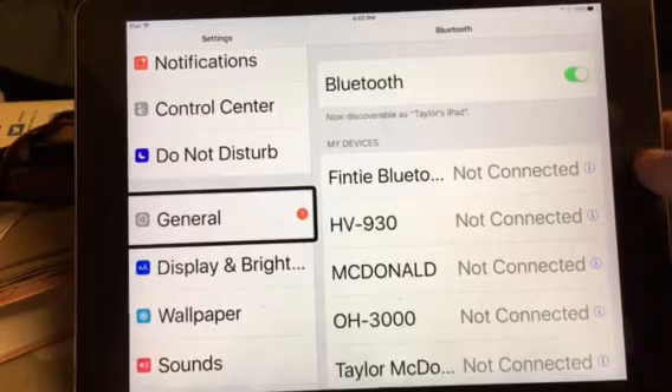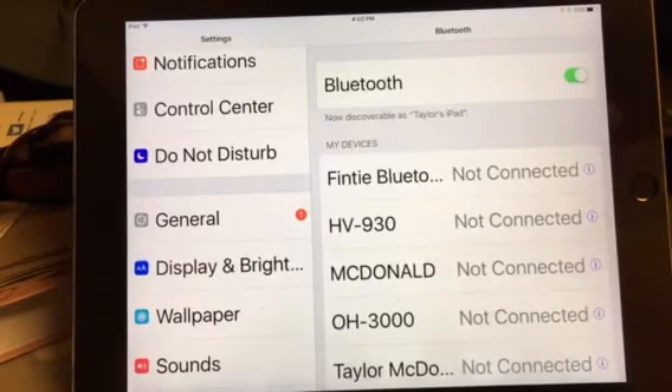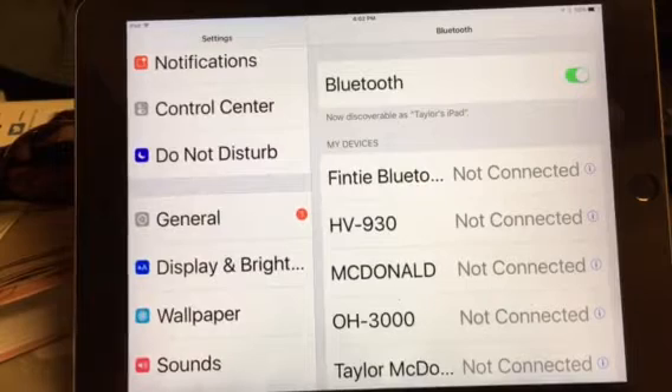Alright, so I'm going to turn off VoiceOver right now. So what you're going to do first is go to your Apex and press from the main menu, which is dots 1, 2, 3, 4, 5, and 6 with the space bar at the same time. Main menu.